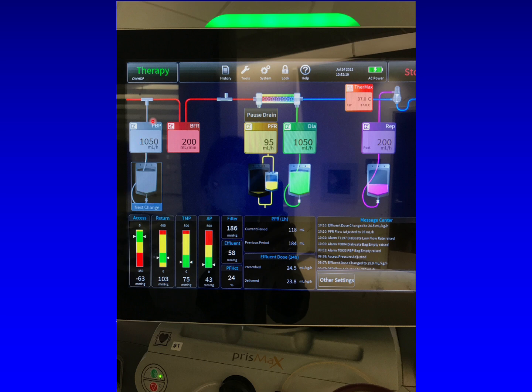And so here we see the blood flowing at a rate of 200 mL per minute through the hemofilter, with effluent being pulled off at a high rate, which is a combination of ultrafiltered fluid that's being sucked through the capillary fibers and any used dialysate that's flowing out of the cartridge, with replacement fluid being added both before and after the filter, usually both, in quantities similar to the total effluent rate, but usually a little less because you're usually needing the patient to be in negative fluid balance with this hemodynamically friendly method of pulling off a little fluid at a time, 24/7.